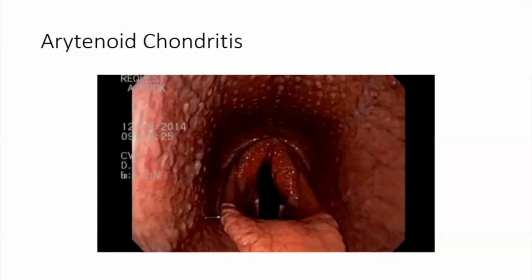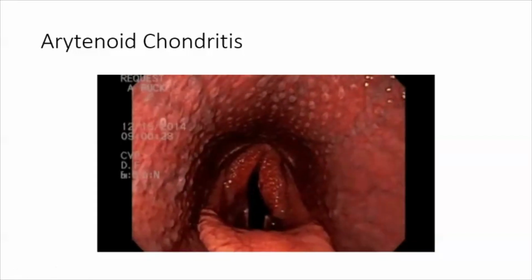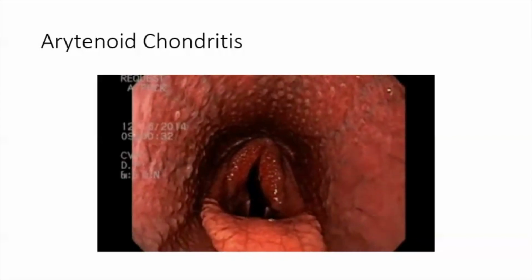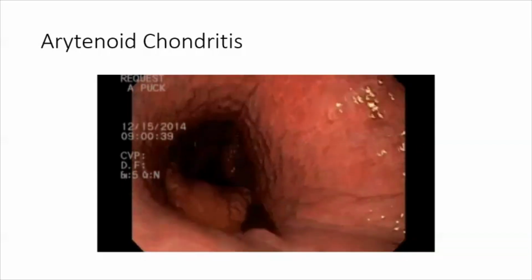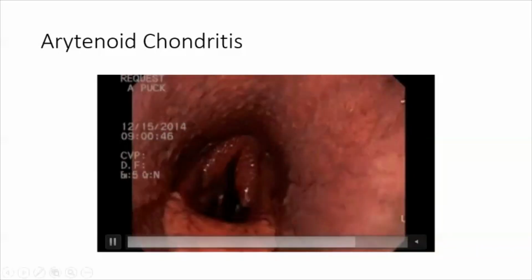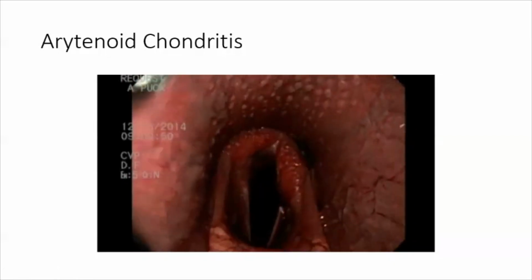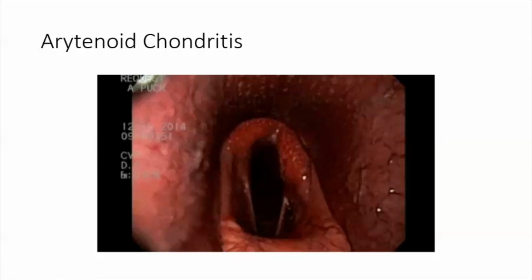Okay. So this is an arytenoid chondritis, or inflammation of the arytenoid. If you look at this slide, I think it'll play for you. The horse's right arytenoid, which again is on your left side, will move up and out of the airway, but the one on your right side, which is the left arytenoid, does not want to move very much. And actually, if you look at it critically, it's also a little bit thickened. So this is an example of an inflamed cartilage. This is not a paralysis problem right there. That's an inflamed cartilage, and that's the reason why it's not moving. It's thicker than normal, and there's inflammation around it. So again, you have to look critically at these when you're scoping the horse to figure out what exactly is going on.